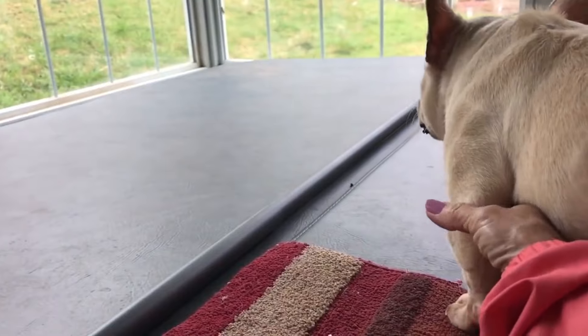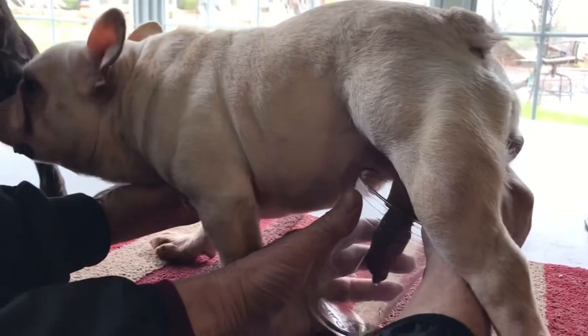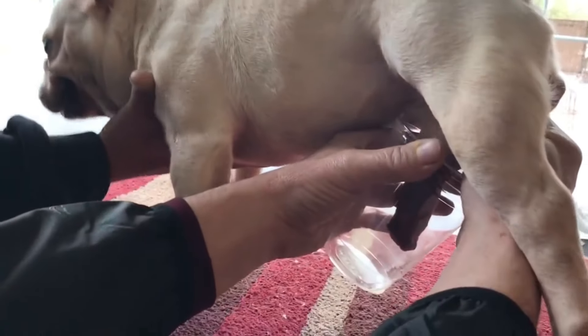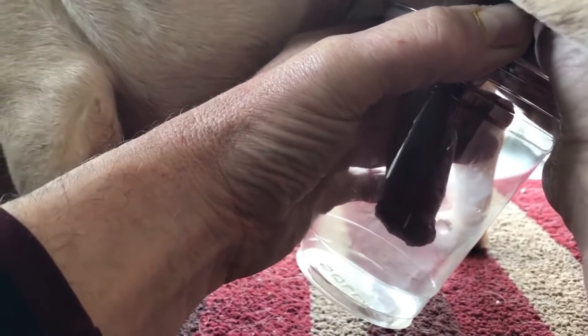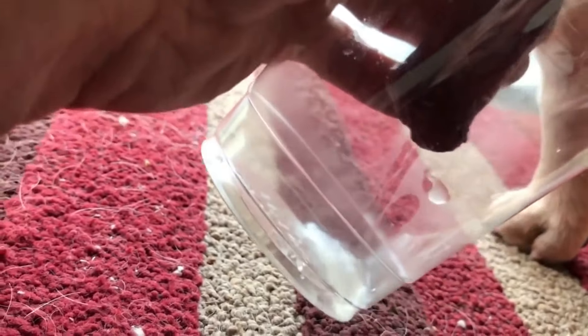I've got hold of him. Look at the back end of him so you can see the testicles. I've got a pretty good grip on it and pretty good control of this dog. He can try and walk away on me, but I'm just going to hang on to him. Now we're going to use the tease dog here to help out the situation. You can see he's starting to produce more. You can see on the side of the cup it's got a milky color to it — that's what's called the sperm rich fraction. There's a drop going down with a nice milky look to it.